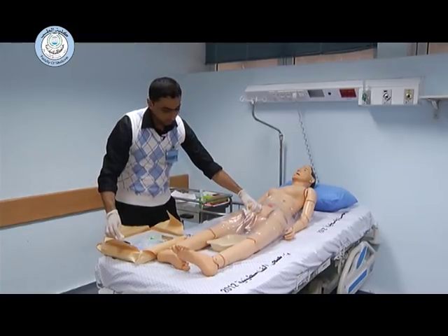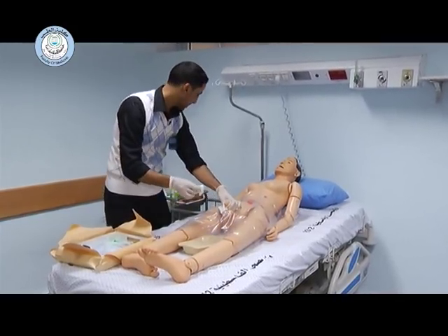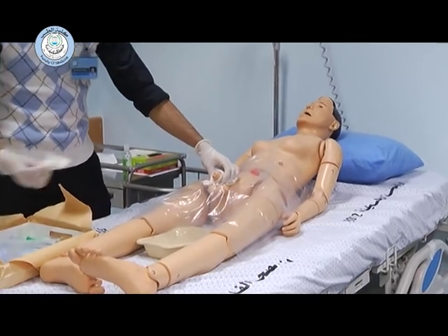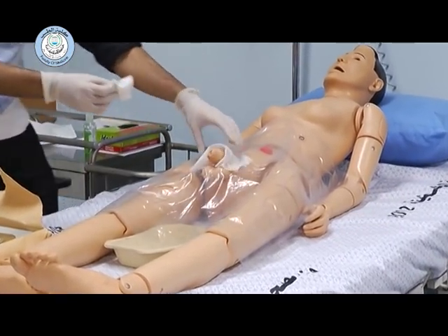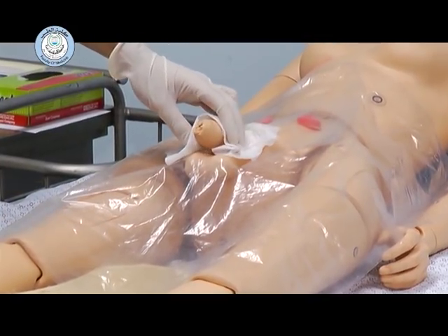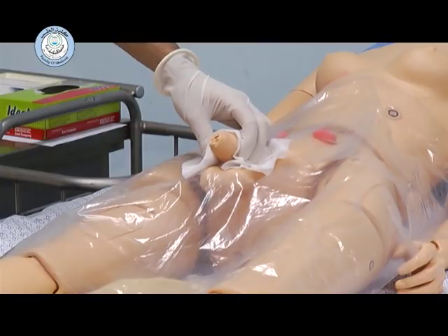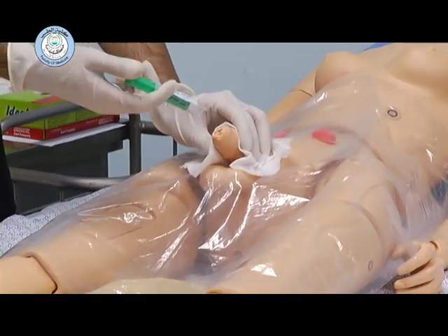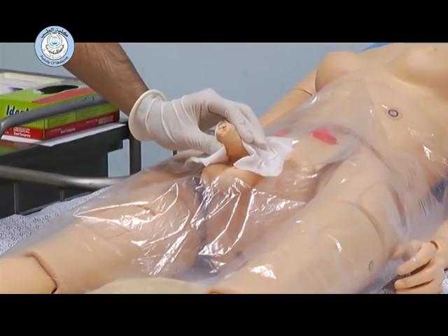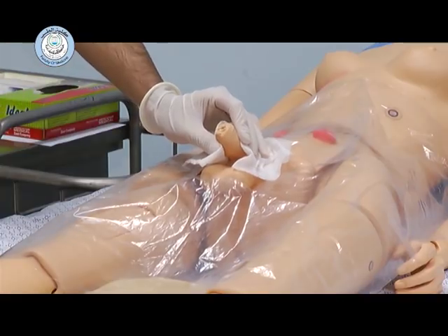You can cleanse the glans penis using the povidone-iodine in this manner. Then after, make sure the kidney dish is nearby before inserting the catheter. Don't forget to apply the KY gel — check the expiry date, it is valid — and tell the patient that it is a numbing agent. Hold the glans penis for a while until the numbing agent takes its effect, for two minutes.